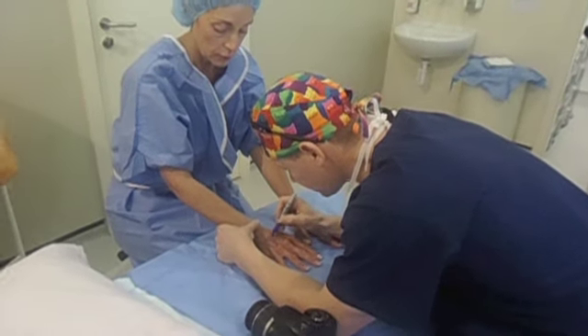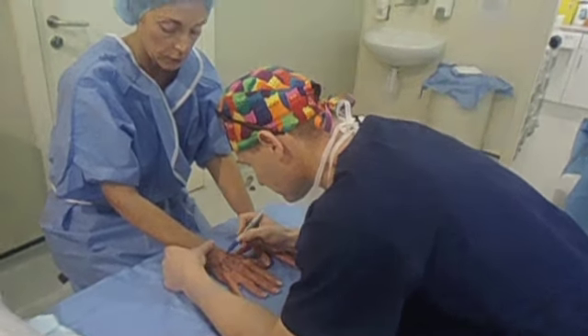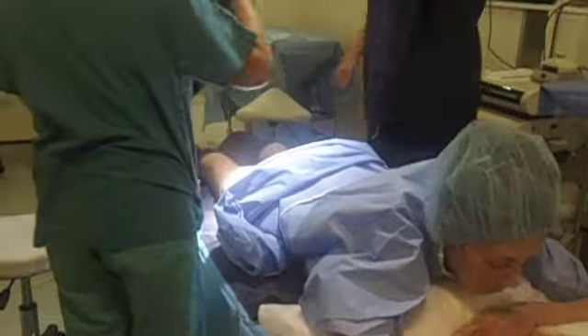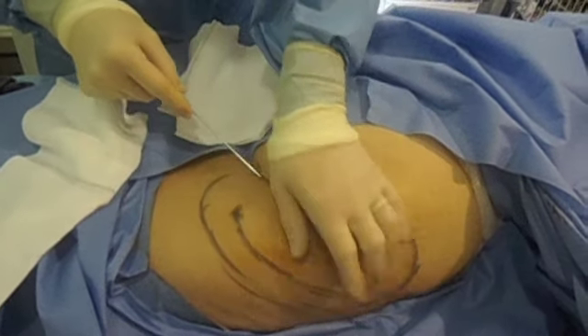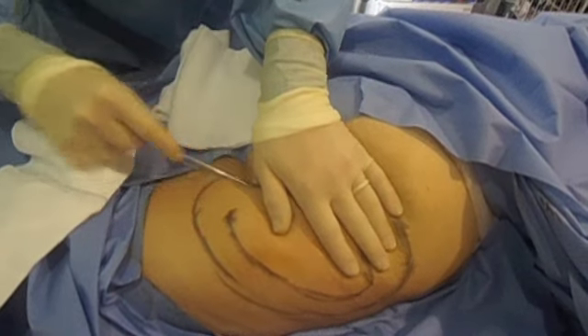Just the indentations. All I'm doing now is just pumping in fluid, and that's just going to numb the area. It's going to sting a little bit, Rosetta.